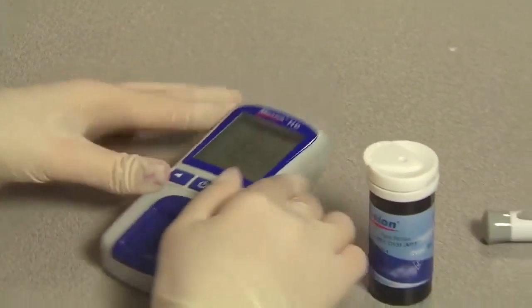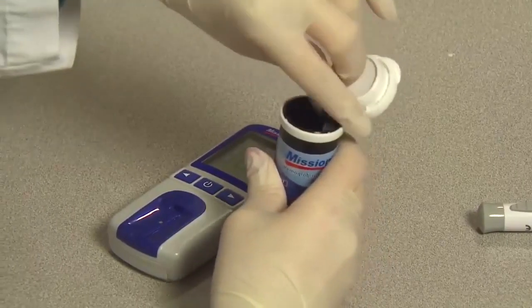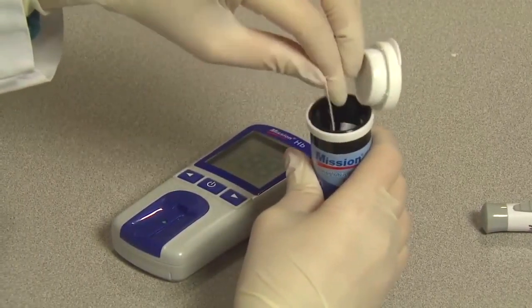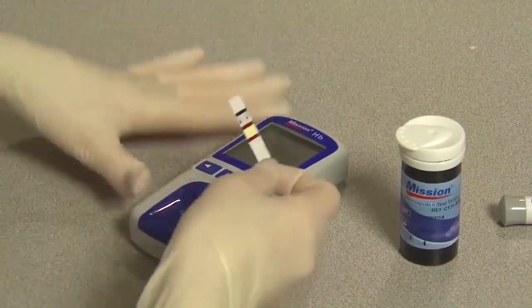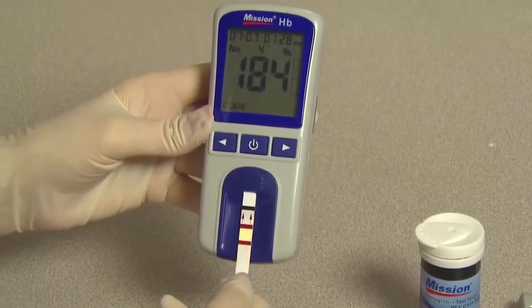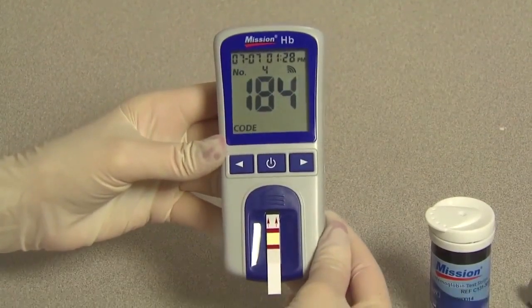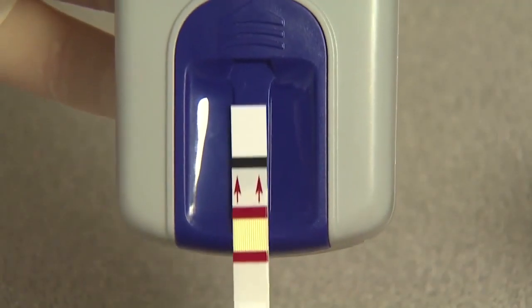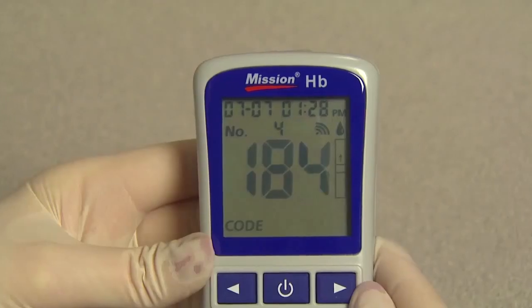To insert a test strip, open the canister and remove one test strip. Make sure you recap the canister after you're done. Firmly insert the test strip into the strip channel in the same direction as the arrows indicated on the strip. Ensure that the test strip is inserted all the way to the end of the strip channel until the white edge of the test strip above the black line is no longer visible.